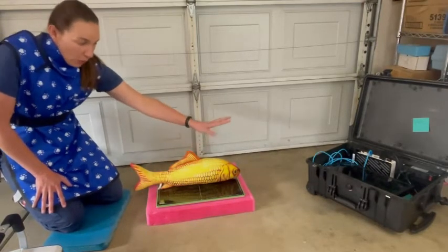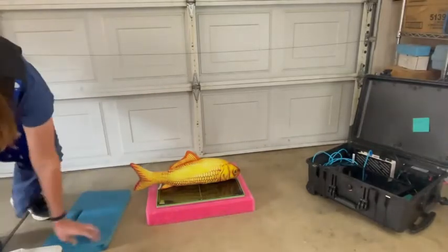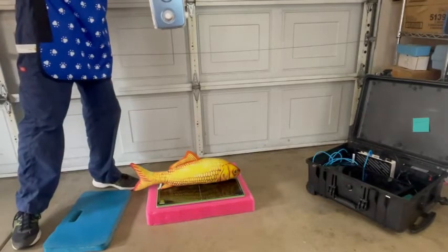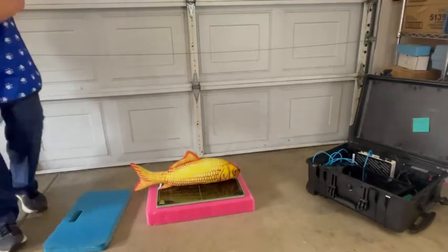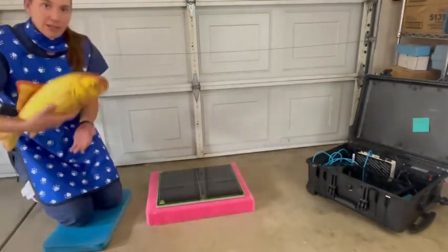Now that we have our fish positioned like this, we're going to be taking a dorsal-ventral view — shooting down through the fish. We take the shot, and then the fish would be put back in the tub.